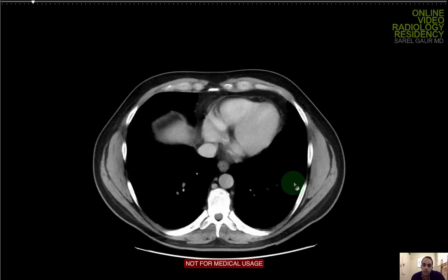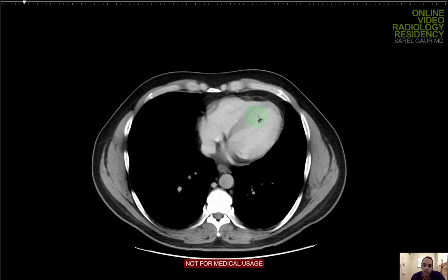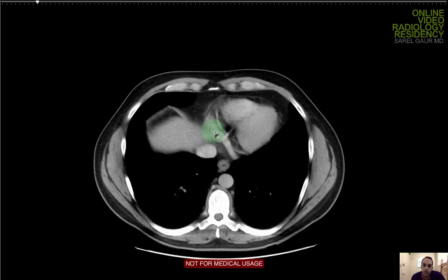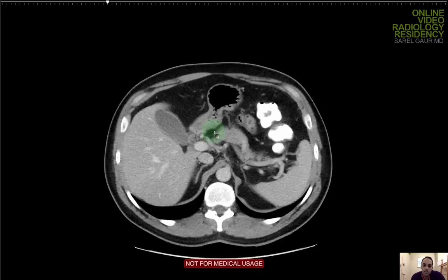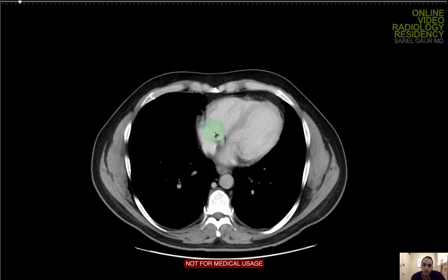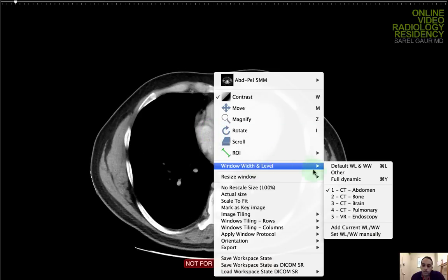Switching over to abdominal windows, looking at the heart, looking for overall size. I'm looking for any pericardial effusion, which I don't see. So the heart is normal size. There's no pericardial effusion.